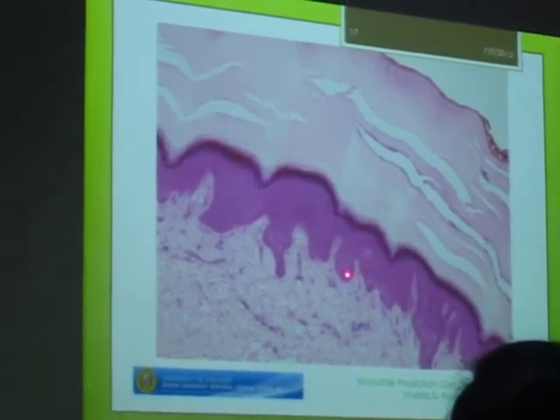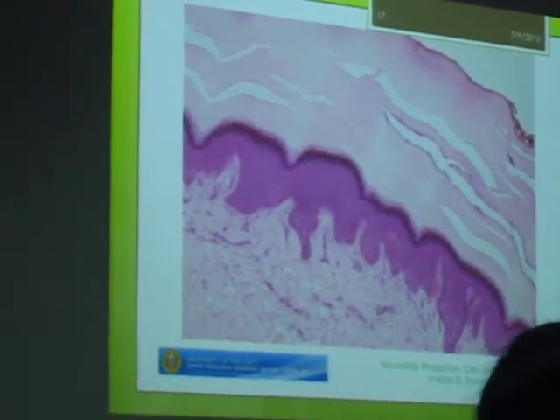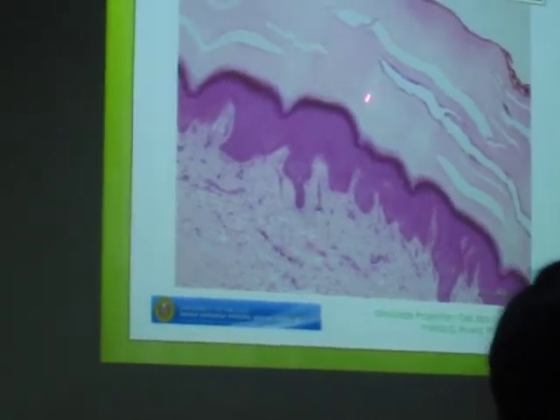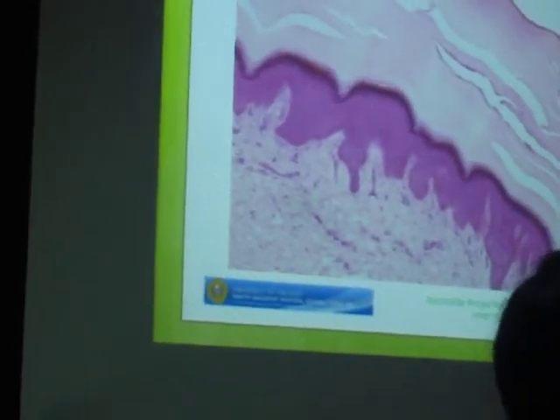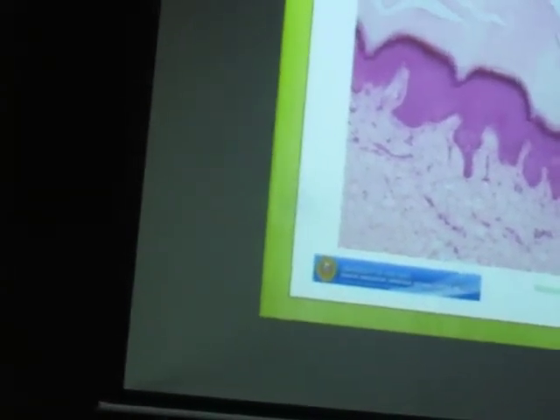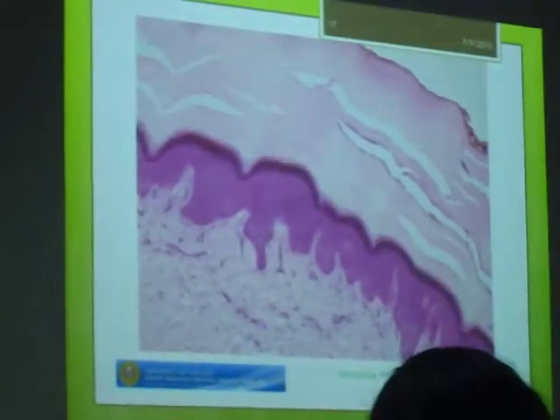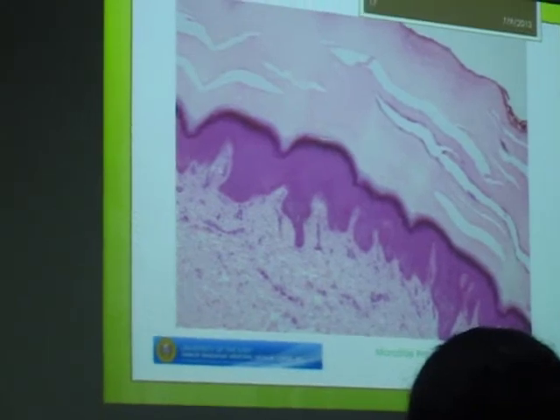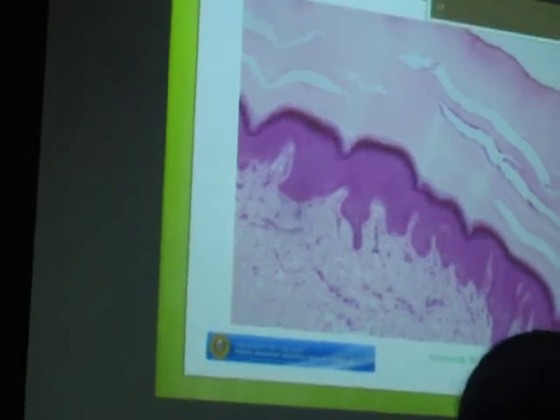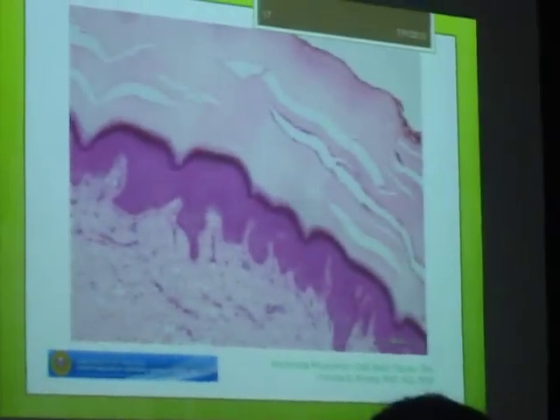Now, classify the bracketed tissue. Classify the bracketed tissue. From this point down to this point. So that's what type? Complete, specific, stratified, squamous, keratinized or the dry type, epithelium. Okay, stratified, squamous, keratinized or dry type epithelium. That's the classification.